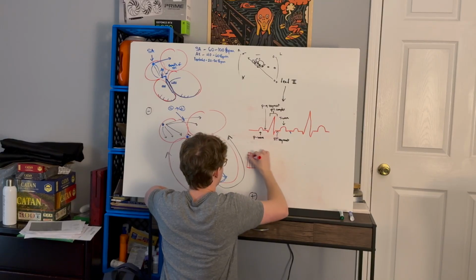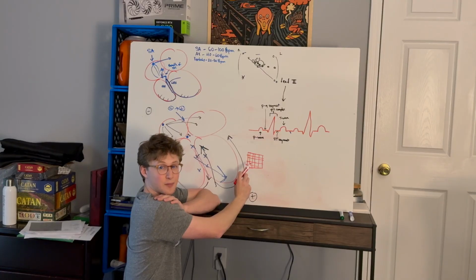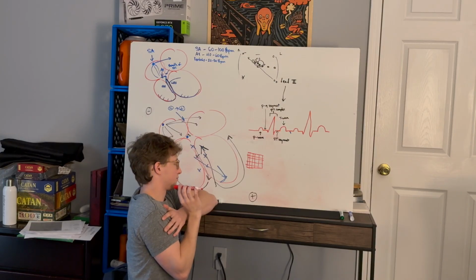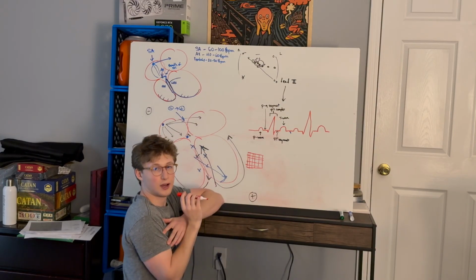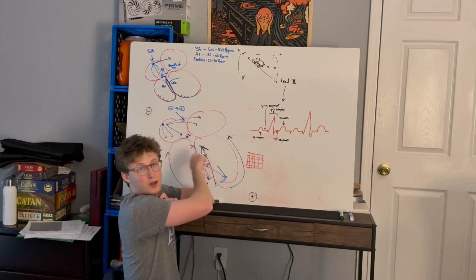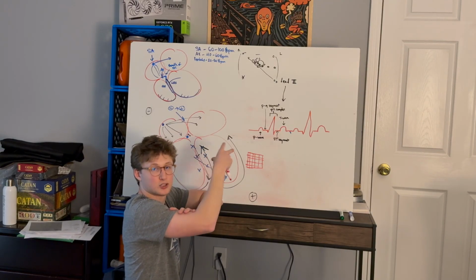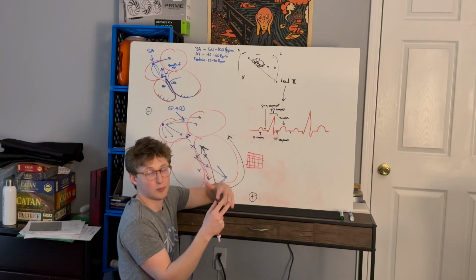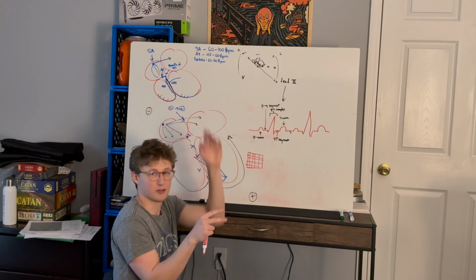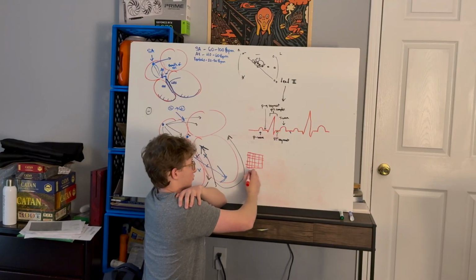This is a terrible picture. But you have these large boxes with small boxes inside of them. The horizontal line is going to represent time, vertical is going to represent amplitude, and that had to do with how strong the electricity, the change in electricity, how much is happening. The more that we see, the more that's happening, the taller our wave will be, or the deeper our wave will be, whichever way it's going. What's most important is time, and that's going to be on the horizontal axis.